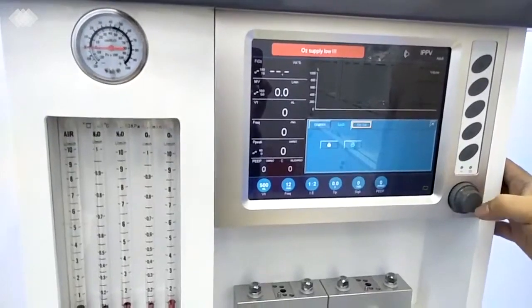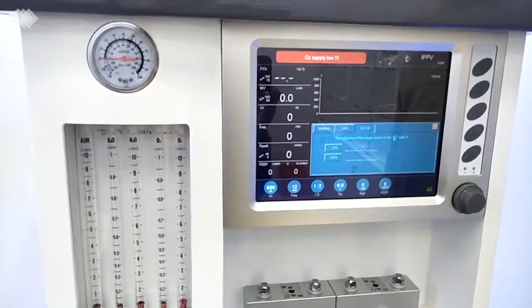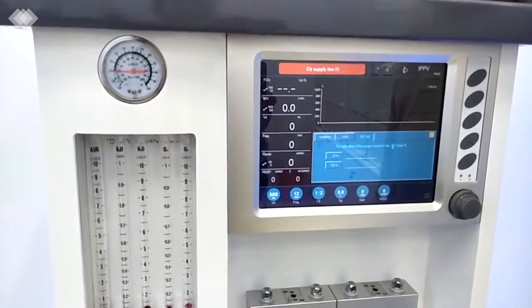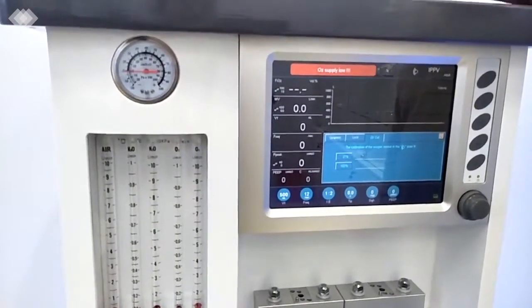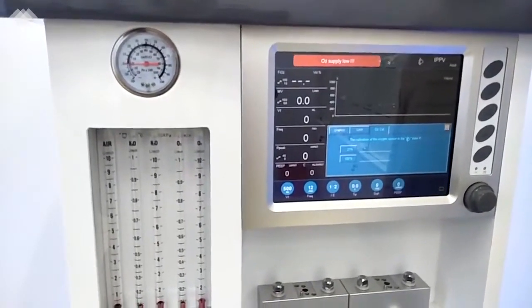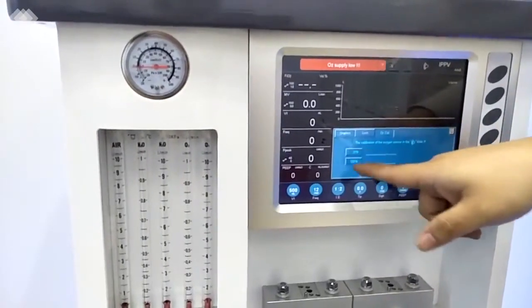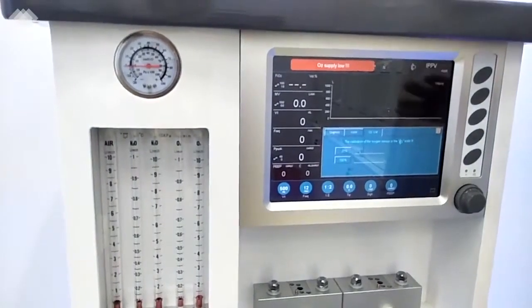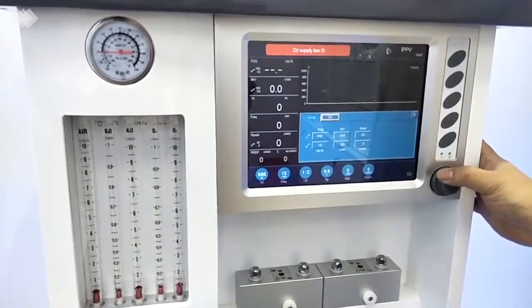And the third one here is for the oxygen calibration. For all our machines, we have the oxygen calibration. Before the machine is shipped, we do the calibration in China, in our factory. But we know in different countries, the oxygen concentration in the atmosphere is actually different. So that's why, as I mentioned first, when you get the machine, you only need to do it one time at 21% and 100%. And also in the installation video, we have the steps to teach you how to do it. Very easy.